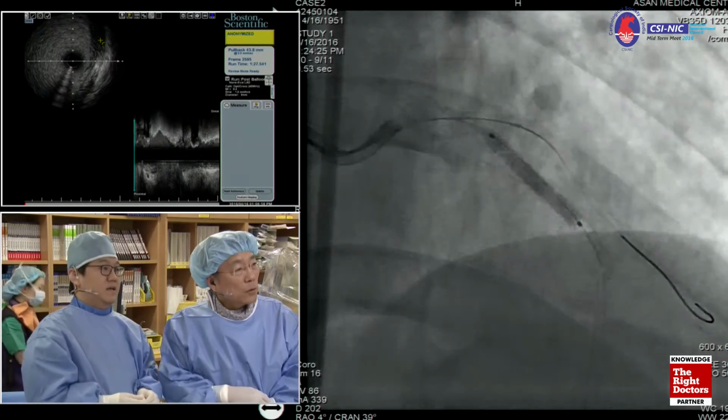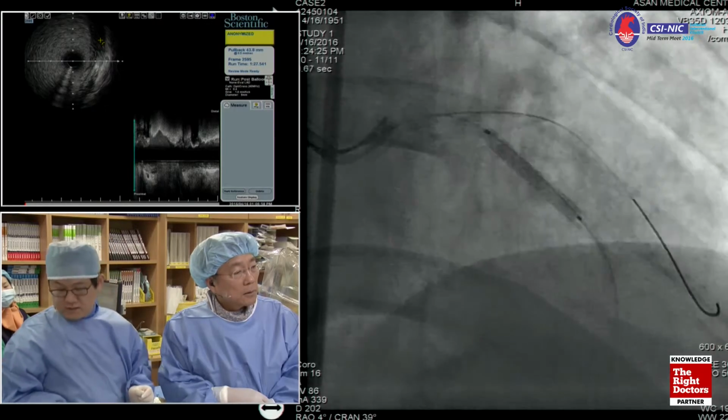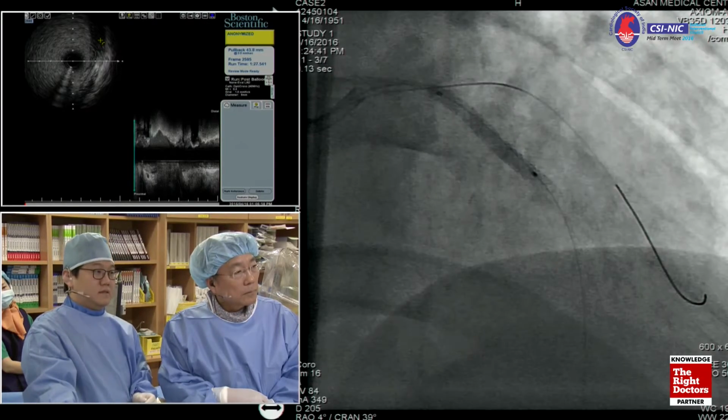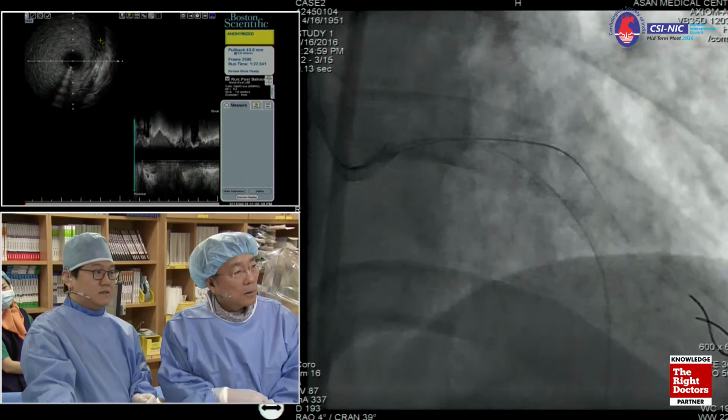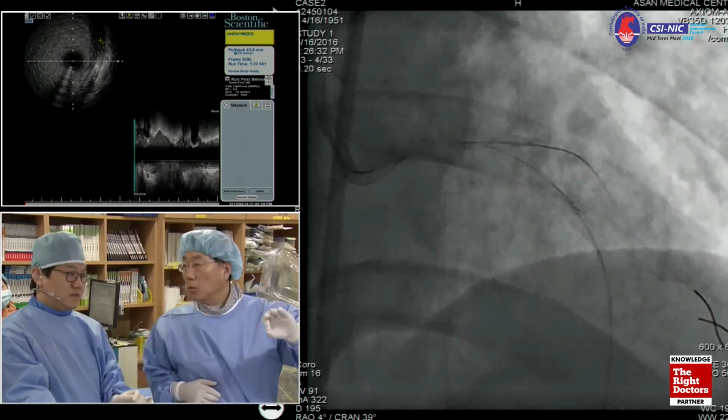3023? Yes. Great. So, could you take a proximal picture here? Next. Next. Okay, good. I like it, right? 3.0? Yeah, 3.0. Okay, why not?